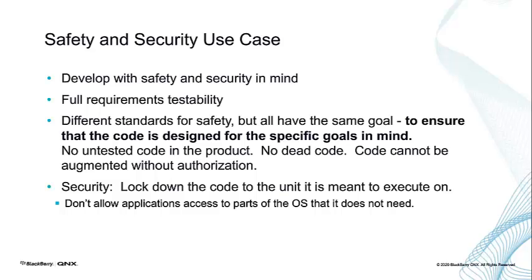A lot of people try and throw these things in at the end, and then, of course, when the schedules are late, then you actually see where, well, do we need to test it all? Can we get away with this testing? How about if we shortchange this one? Oh, we changed this feature. Do we really need to retest everything? And the answer is if you do it from the beginning, then your system is always tested to the level that you've tested it at, and each component is tested along the way. So ensure that you do that.